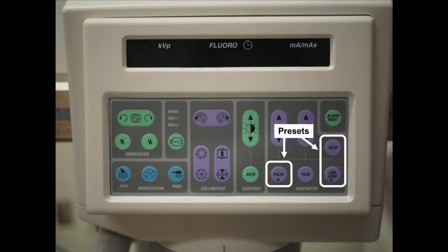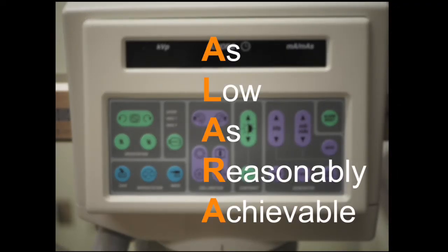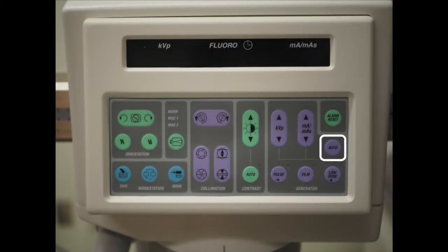However, typically we do not need to adjust the kVp and milliamps ourselves, but can use presets to help keep the radiation dose as low as reasonably achievable, or ALARA. ALARA is a standard in radiation safety, aiming to minimize radiation exposure to both the patient and the providers in the room. By selecting the Auto button for automatic exposure mode, the system calculates the needed voltage and amps for an optimized image. This helps improve the image quality while minimizing the radiation dose. The Auto mode is usually adequate for bronchoscopy.